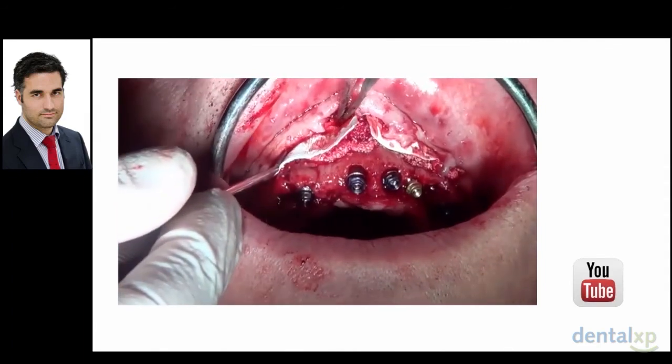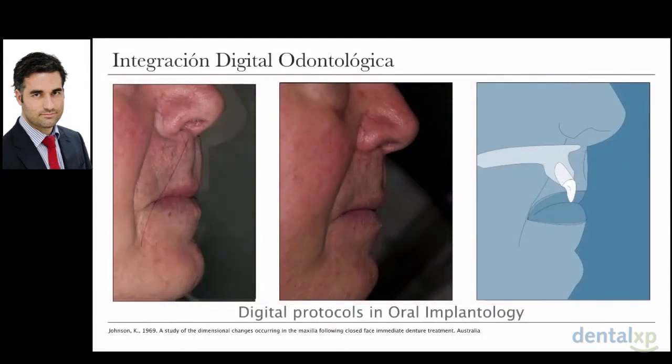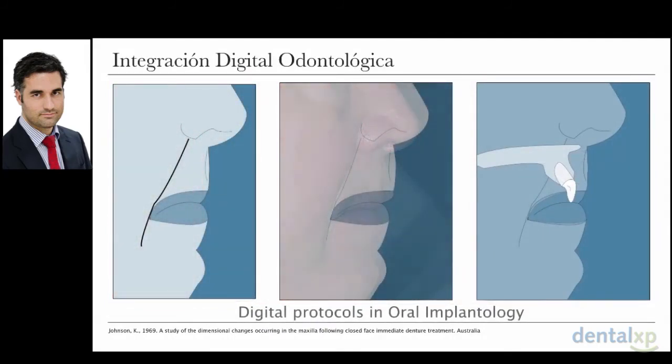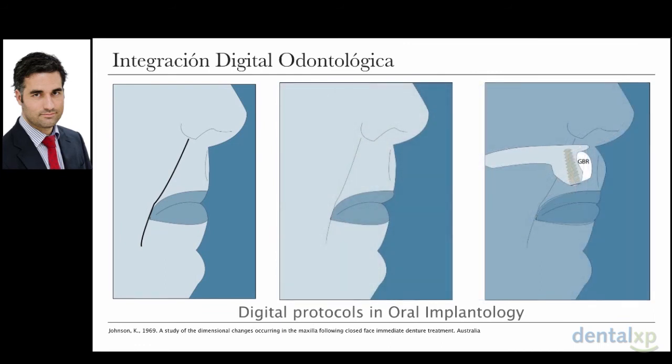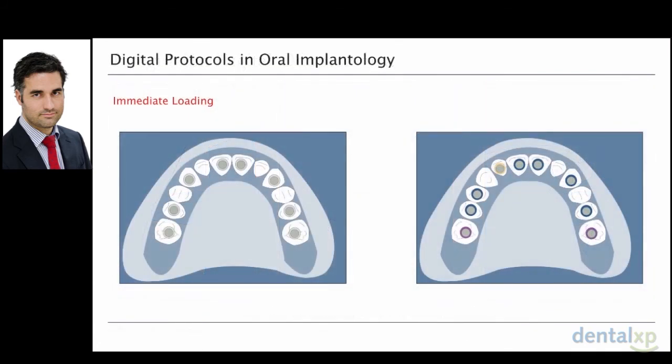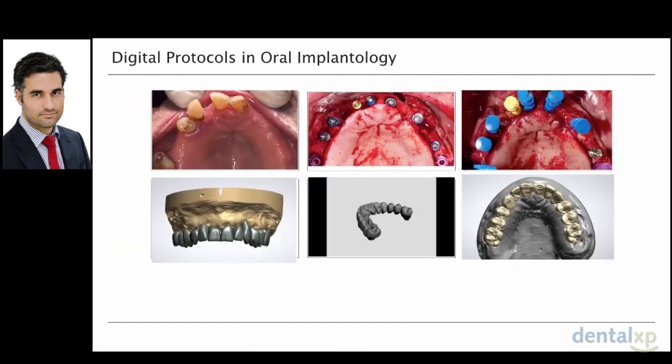Okay, here you can see the concept, and on the right you see the lip support will be enhanced with a biomaterial. This is what was planned on the left, and what definitely I did, 9 implants instead of 8.